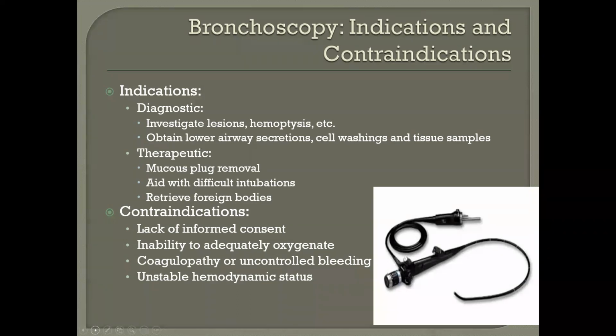And the physician said, "You think I can get it?" And we said no. So they ended up going down to the OR. They did a rigid bronchoscopy and were able to do minor surgery to remove the screw and excise any infected tissue and that sort of thing. But when the physician asked, "Do you think I can get it out?" I said no, just say no.